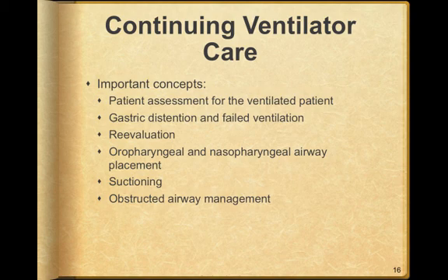The patient, do they have an open airway? What are their anatomical features? Are there any pathological features? The mask seal, is it correct? Equipment, be sure that you're familiar with the equipment. Masks, oxygen sources, and ventilators will be some of these. Oropharyngeal and nasopharyngeal airway placement.